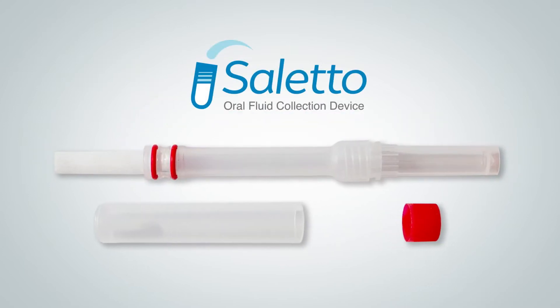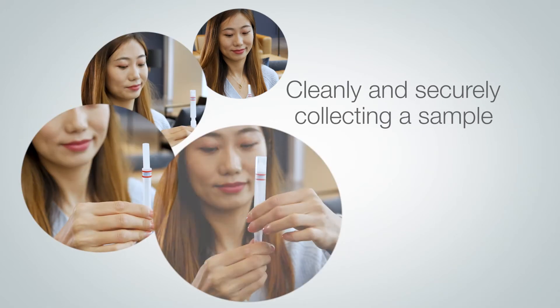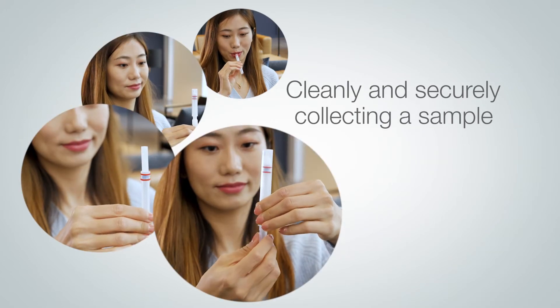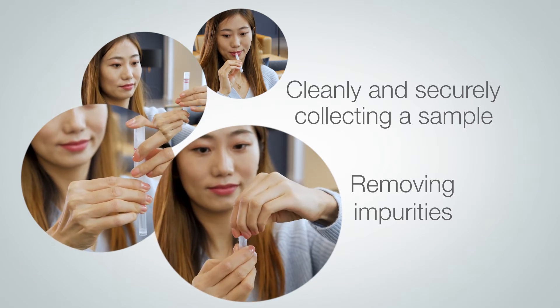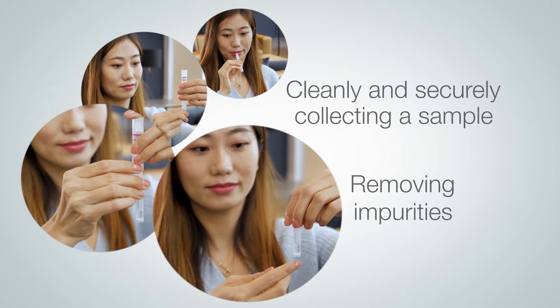The Saletto oral fluid collection device is furthering saliva-based diagnostics by cleanly and securely collecting a sample while simultaneously removing impurities, saving valuable time and resources in the laboratory, and getting you a quicker result.